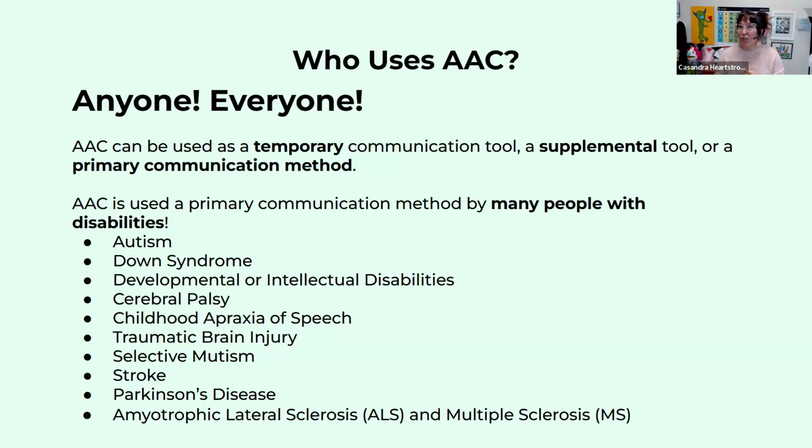It may be a supplemental tool for individuals who have those mouth words, but need it to communicate when they're around people who don't have that listening ear that understands their mouth words. You can probably think of a few students that you know that the people around them who know them best can understand their mouth words, but others can't.